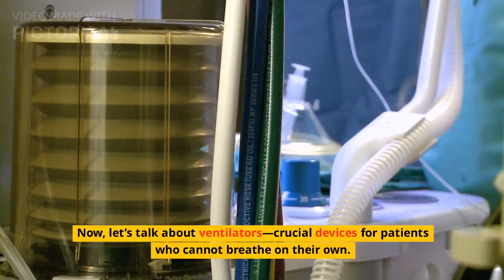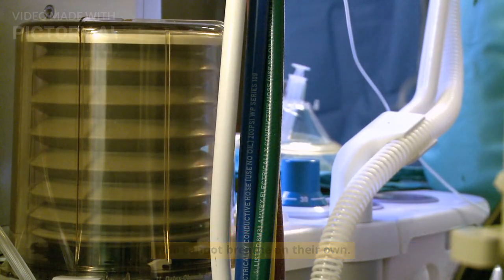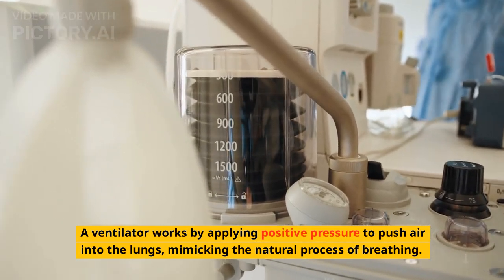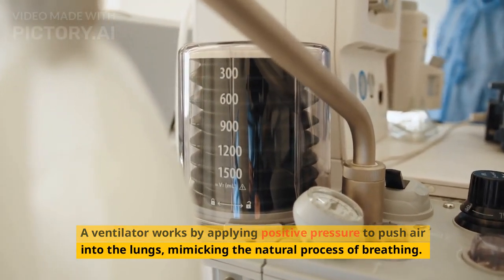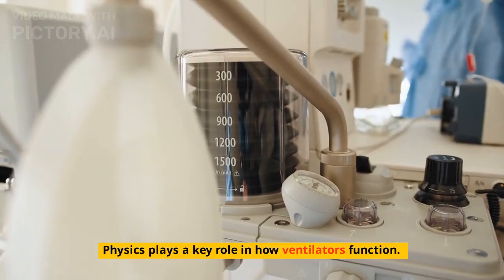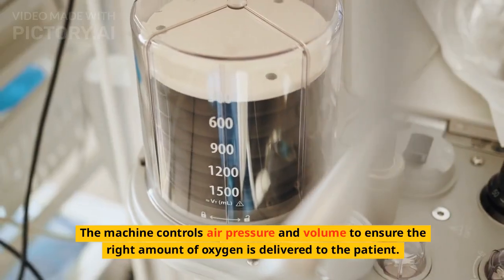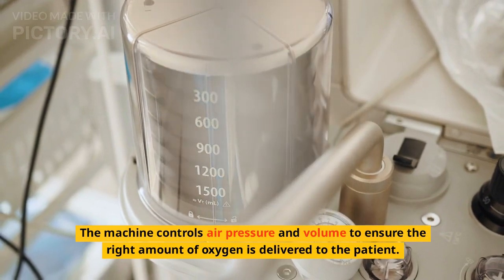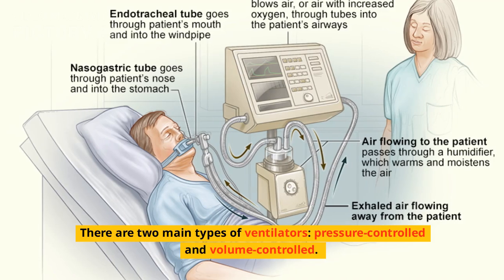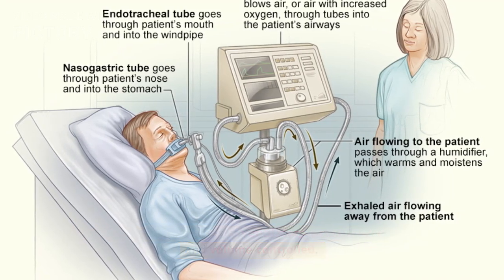Now, let's talk about ventilators, crucial devices for patients who cannot breathe on their own. A ventilator works by applying positive pressure to push air into the lungs, mimicking the natural process of breathing. Physics plays a key role in how ventilators function. The machine controls air pressure and volume to ensure the right amount of oxygen is delivered to the patient. There are two main types of ventilators, pressure-controlled and volume-controlled.